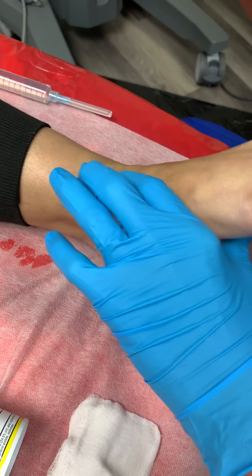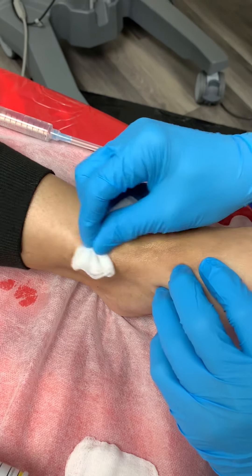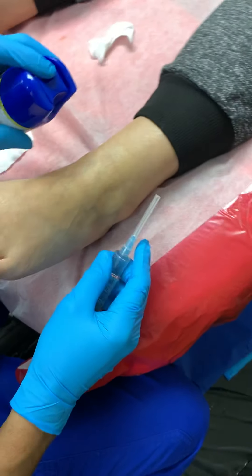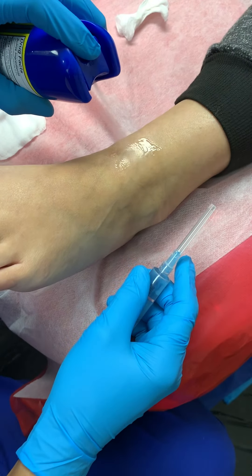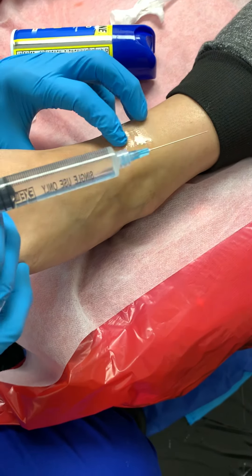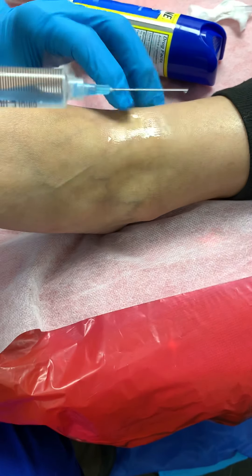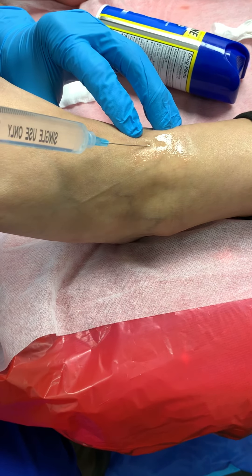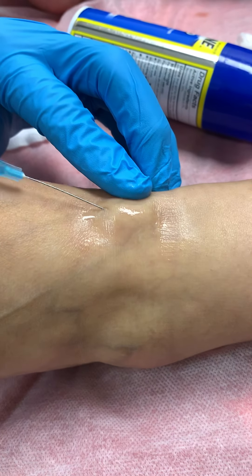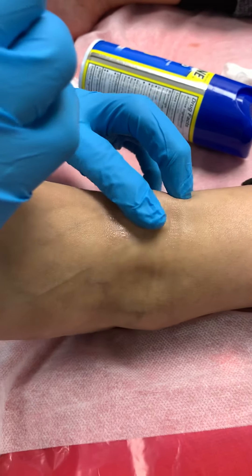Now Dr. Nunez is going to inject several other nerves. These branches are really important because they provide sensation to the entire top of the foot. This is what he just injected — the deep peroneal nerve.